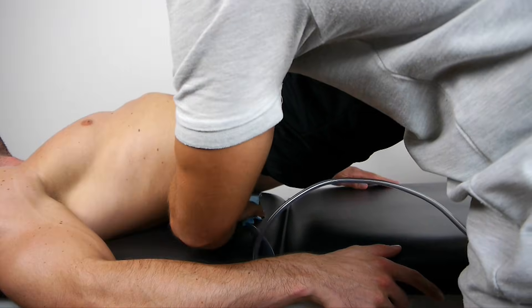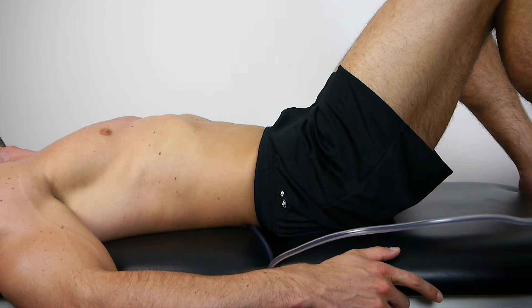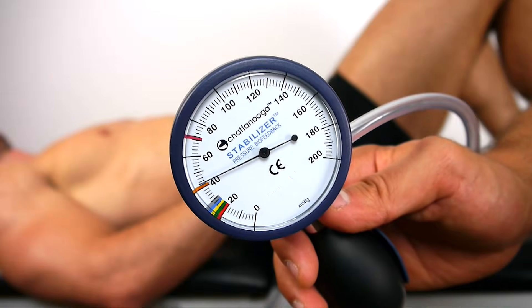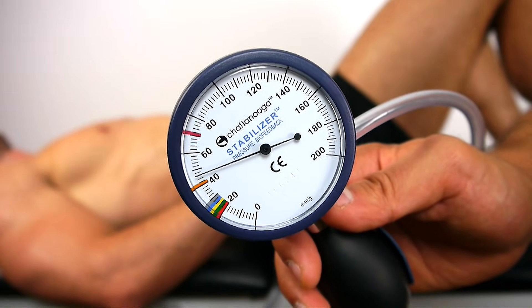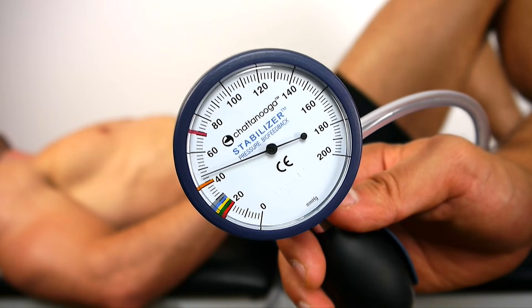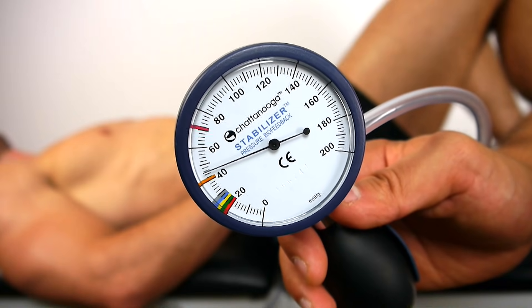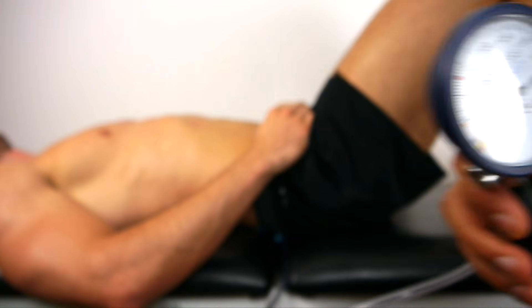In the third step, place the pressure biofeedback unit under the lumbar spine at the height of L3 and inflate the cuff to 40 millimeters of mercury. The patient is then instructed to perform the abdominal drawing maneuver and increase the pressure in steps of 2 to 4 millimeters of mercury — so from 40 to 42 or 44 and so on.